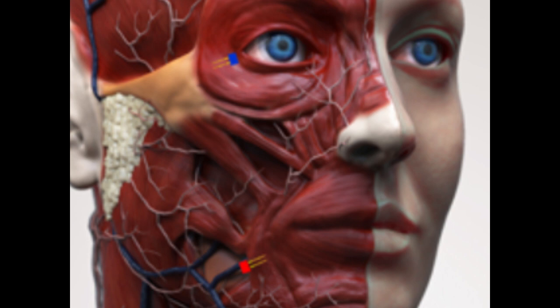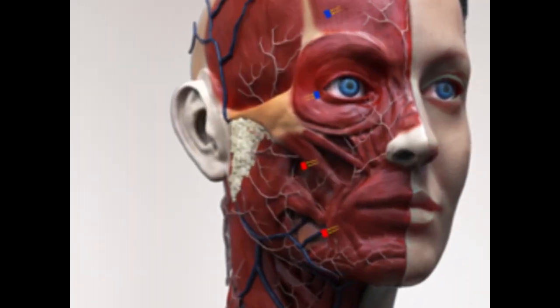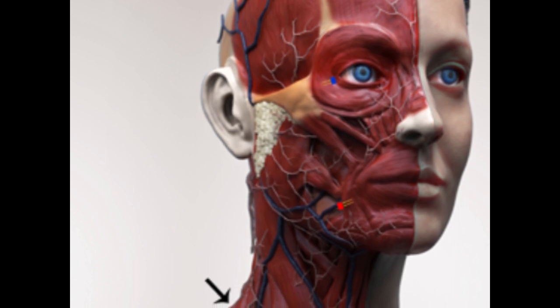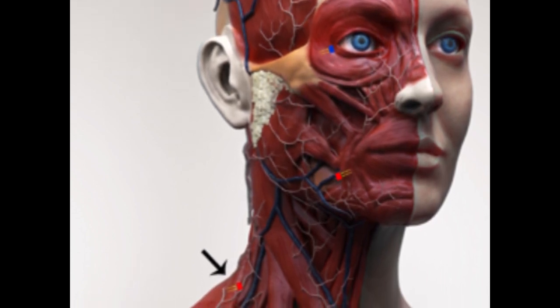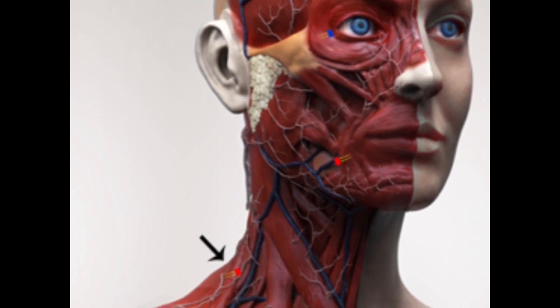The zygomatic branch of the facial nerve is monitored by placing a paired lead in the orbicularis oculi muscle. Note that the tip of the paired lead in this location is placed in a direction away from the globe. If the surgeon wishes to monitor additional nerves or nerve branches, then additional muscles may be used with up to four leads.